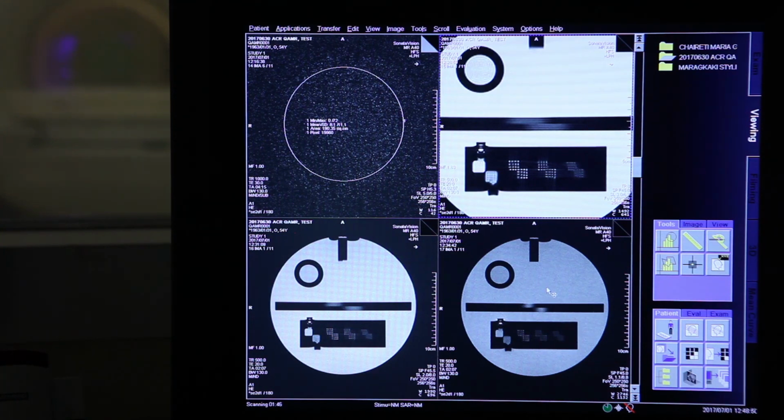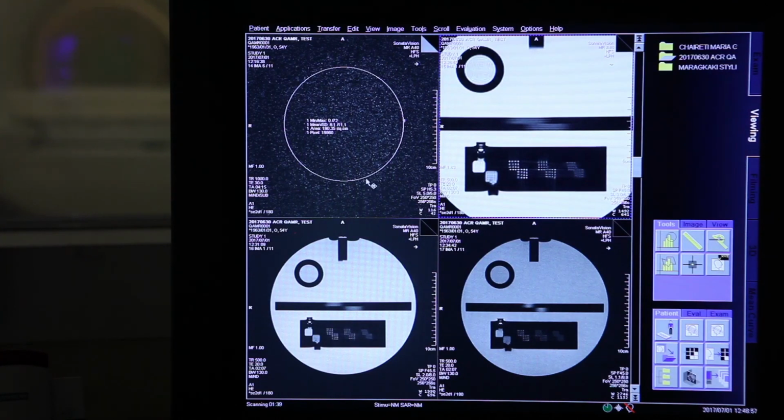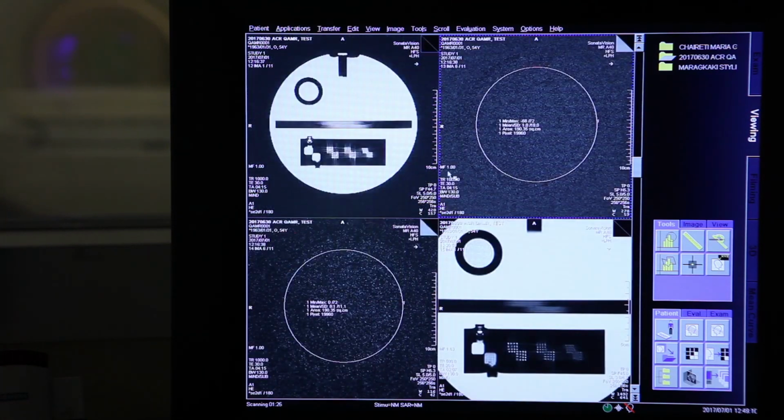An important issue here, and that's a question for you now: what would be your suggestion if I was about to measure the SNR for each pixel, not for an ROI? Could we do that? Let's say we use the SNR2 method. You have to be alert, you have to know that we're measuring SNR of this specific area. So we have a large ROI, which is what NEMA standards recommend, right? But my question is, if I was about to measure the SNR for each pixel, do you think that this method will help?